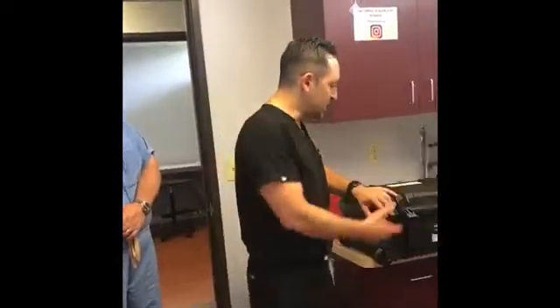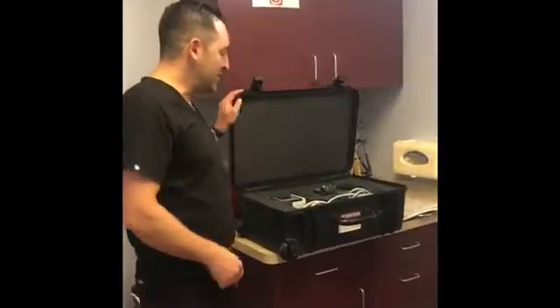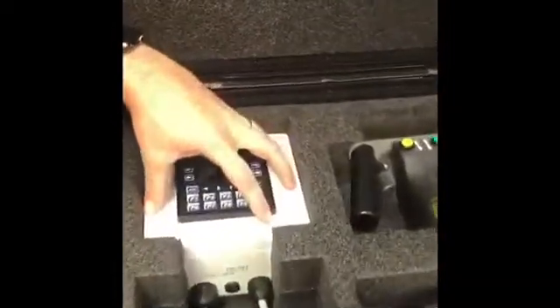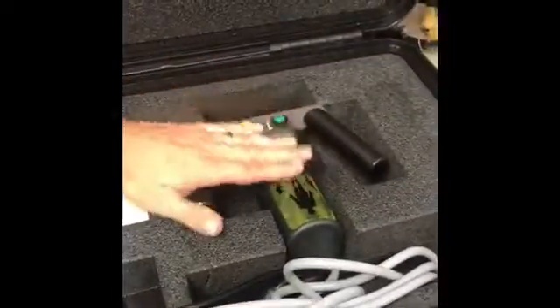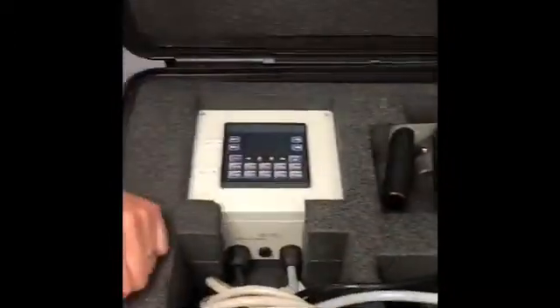Today we're going to show you guys how the ERC works. This is the external device that we're going to use to help stride nails lengthen over time. This is the box, and as you can see inside, there's all the equipment. There's a computer that's attached to it. This is the actual device that communicates with the nail, and we're going to show you guys how it works.